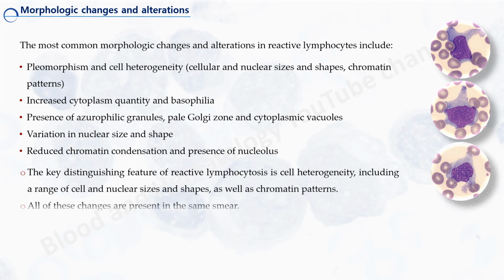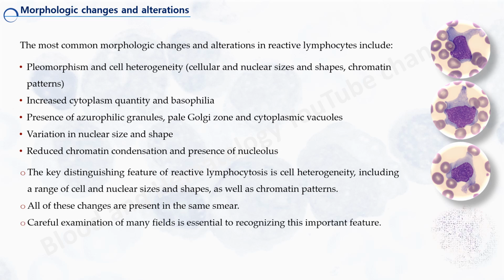nucleus sizes and shapes, as well as chromatin patterns. All of these changes are present in the same smear. Careful examination of many fields is essential to recognizing this important feature.